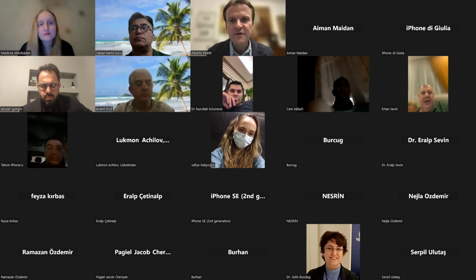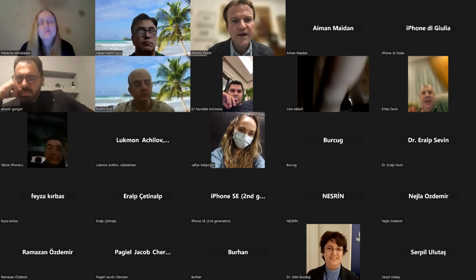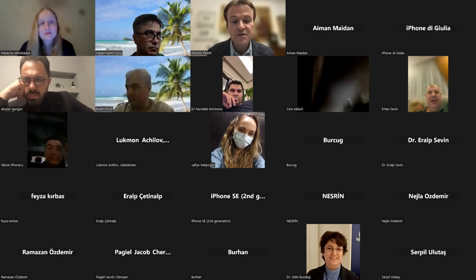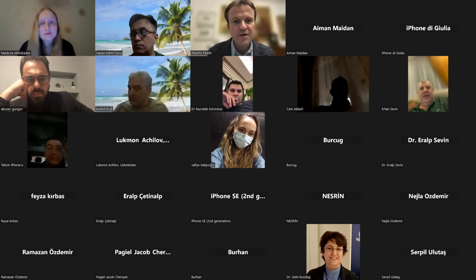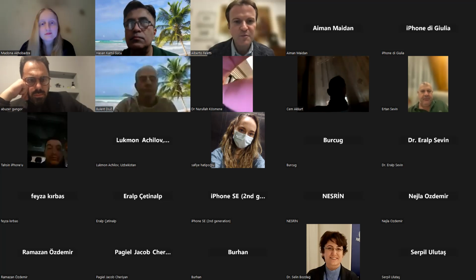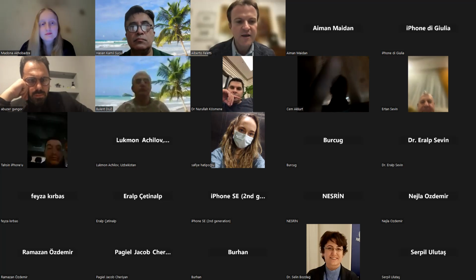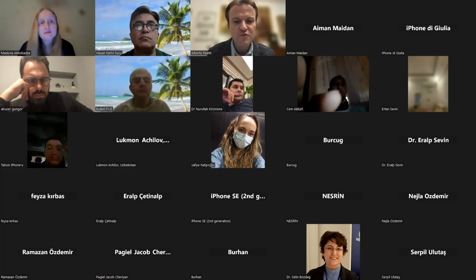However, after awakening, the patient awoke very well. And 1 hour later, she deteriorated. She went into coma. I did a CT scan, and there was a huge, massive intraventricular hemorrhage, which I aspirated with a flexible scope.